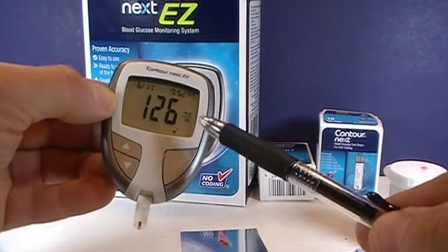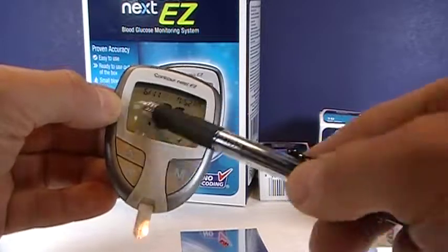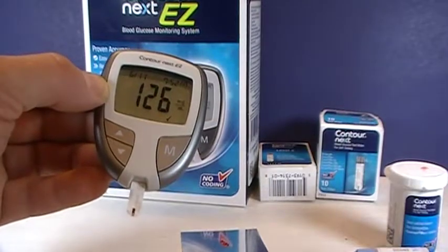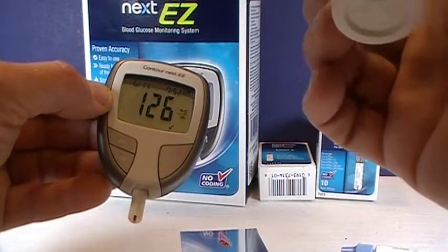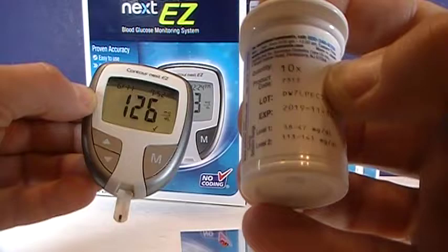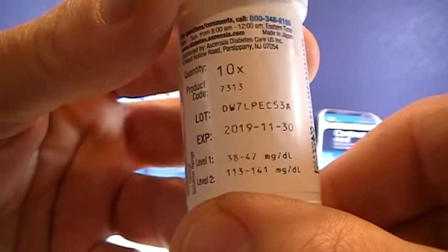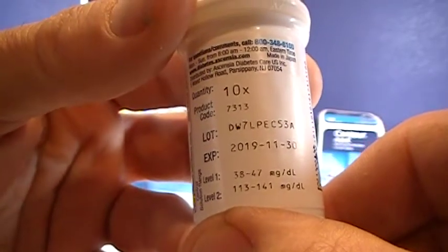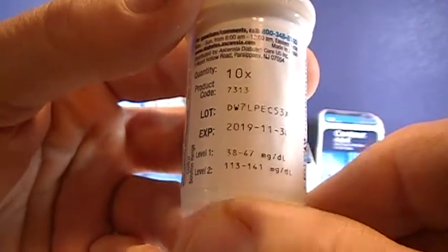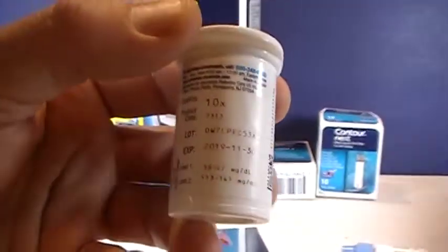You'll notice that a check mark indicates that the meter determined that this was control solution. That doesn't mean that the number is right — it just means that the meter has determined this is a control solution that won't be used in your averages. Look at your bottle of test strips: level 2 should come between 113 and 141 mg per deciliter. Ours was 126, so that means this bottle of strips is calibrating just fine.